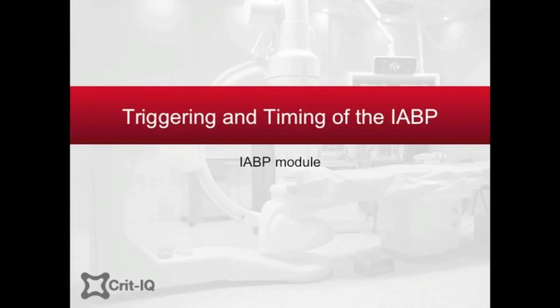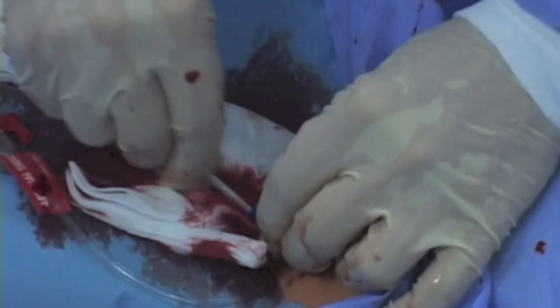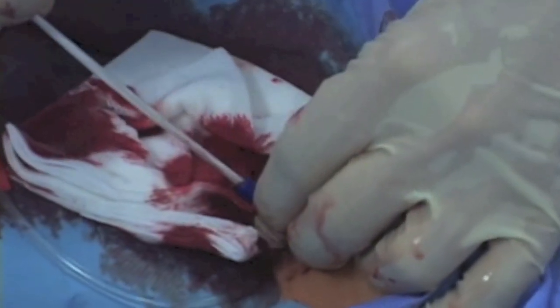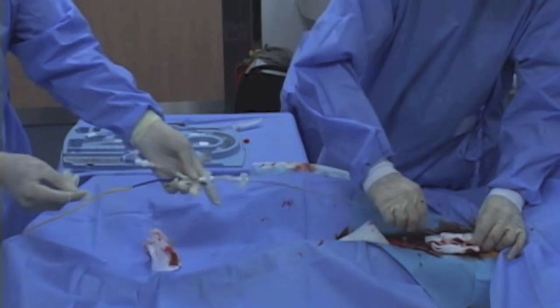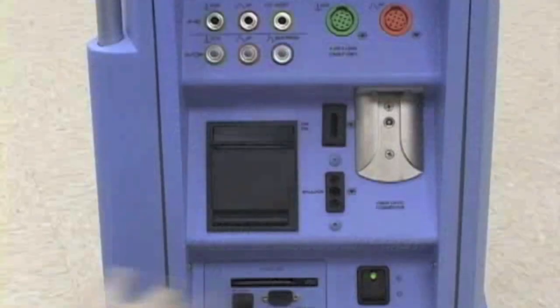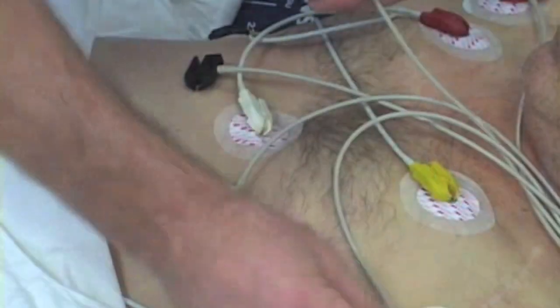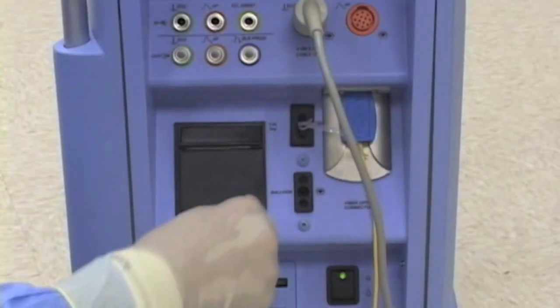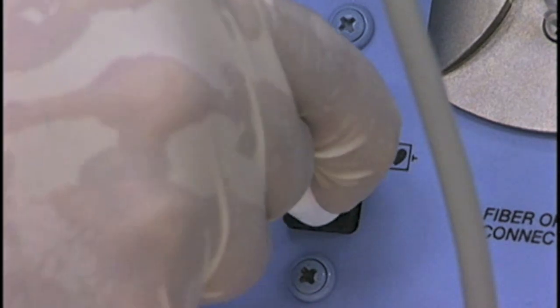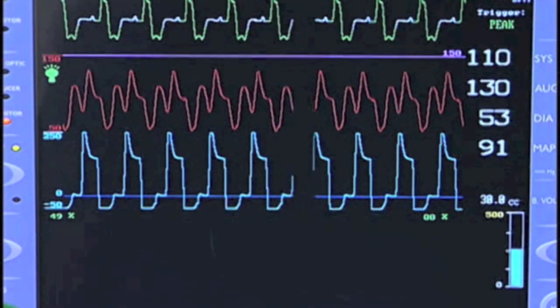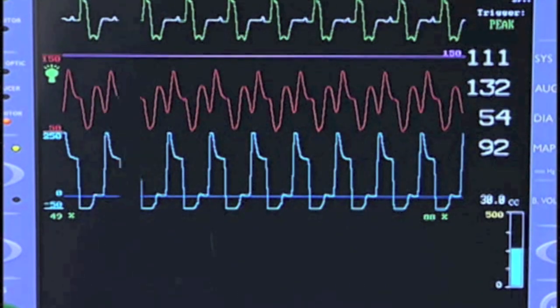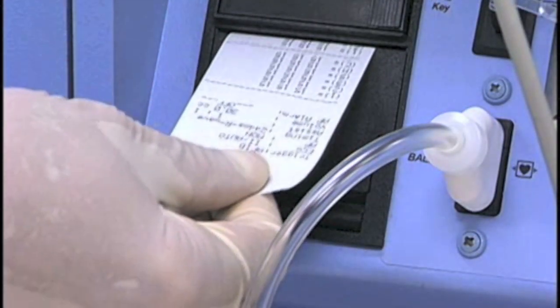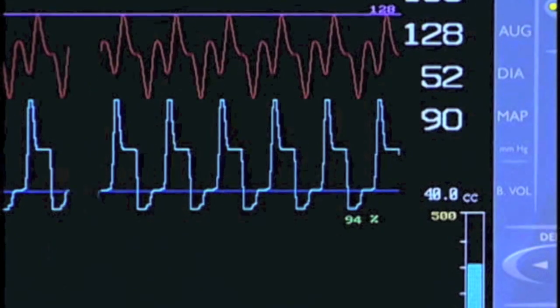Timing and triggering of the intra-aortic balloon pump. Once the intra-aortic balloon pump catheter is inserted, the console must be programmed to deliver therapy appropriate to each patient. To do this most effectively, the patient must be connected to the pump console via both the ECG and arterial pressure, enabling continuous monitoring of both waveforms to optimize recognition of the phases of the patient's cardiac cycle. The clinician can also use these waveforms as a measure of the efficacy of therapy.